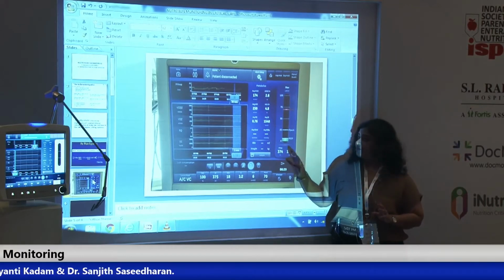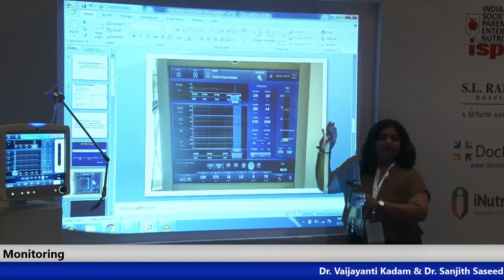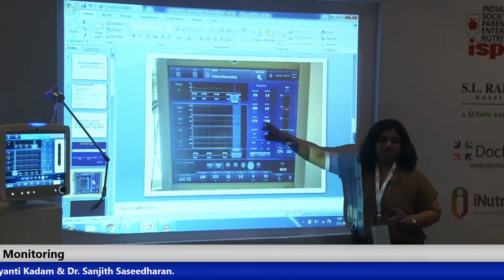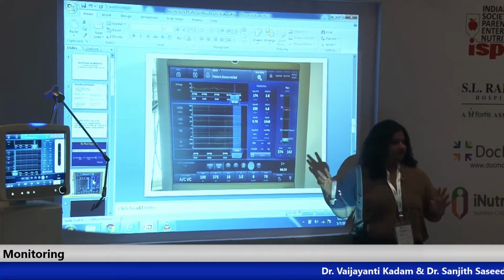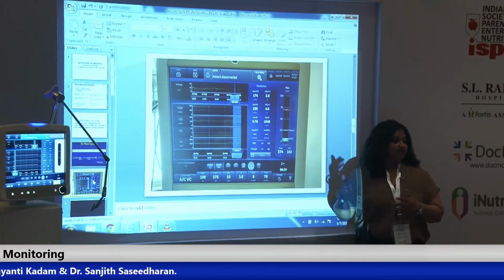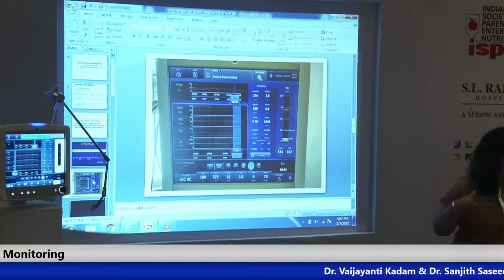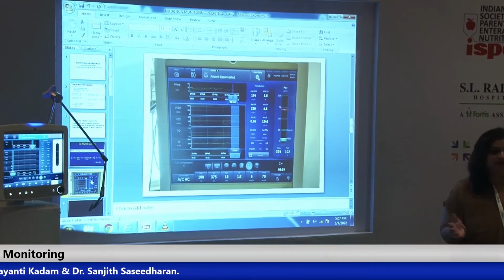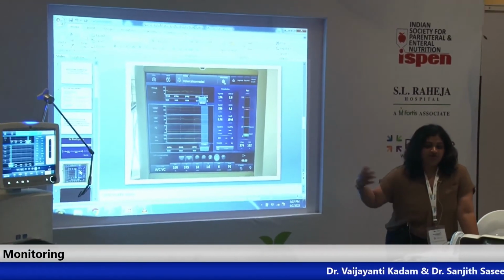Clear everyone? So this is the energy requirement for my patient. We have to give our patients 90 to 100% of this energy expenditure, so my calorie requirement should be somewhere around 1400 to 1500. Clear everyone? How often do we do this? If a patient is very critical, we have to keep doing it within 72 hours. If they are stable and just require ICU for supervision, usually we may not require such frequent readings. We don't keep doing it every 24 hours.